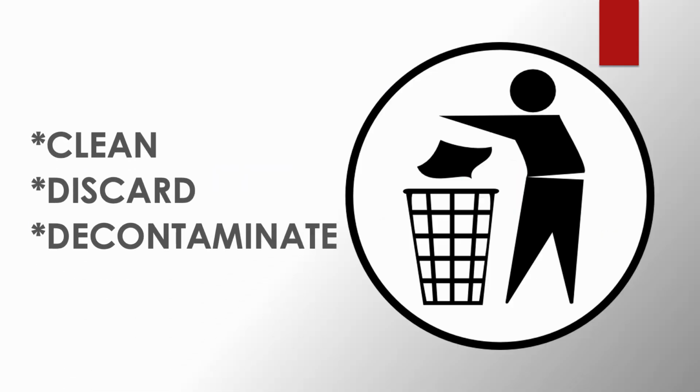To maintain a safe and healthy environment, clean the surroundings of the patient once done. Discard according to the waste segregation policy. Make sure that you discard your gloves, the paper towel that you used, and also the disposable thermometer. Once done with these, make sure that you decontaminate your hands using the antiseptic hand spray.